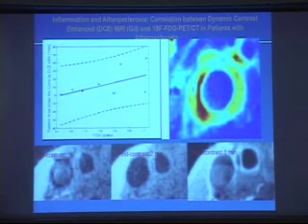very nice delineation of a separate area. This is between the fibrous cap and the outside. This is where the lipid core is. So you're starting to get additional information just visually.